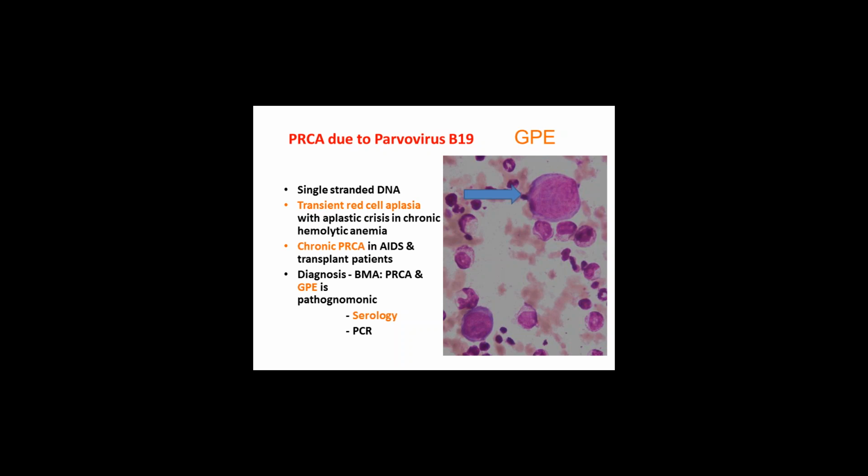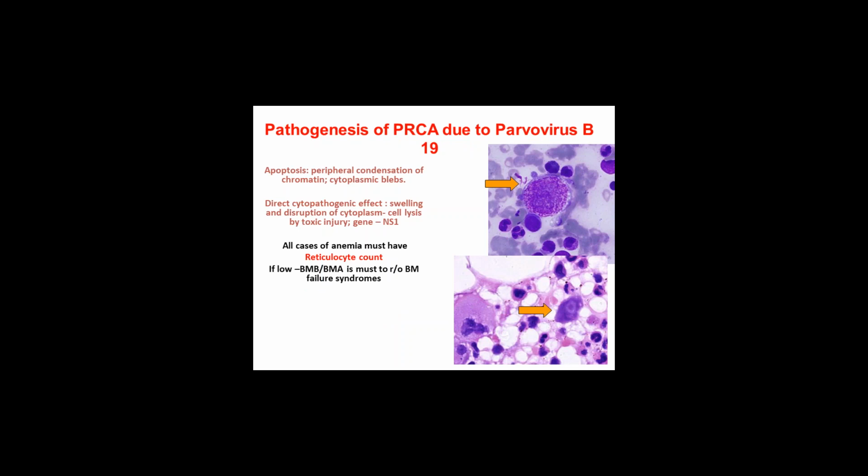The cytoplasmic projection along with the nucleoli gives it what we call a dog-ear appearance. Now, this is showing the very prominent nucleoli. The lower slide is of a biopsy specimen, and here also we can see prominent nucleoli.